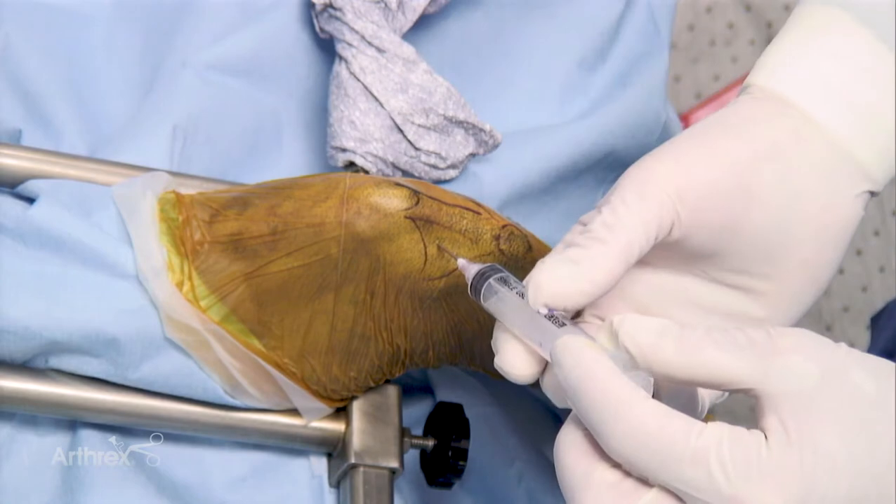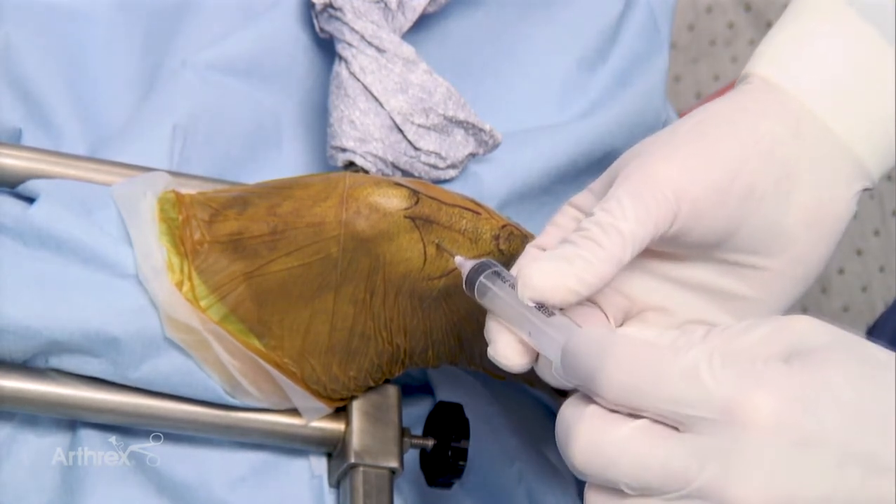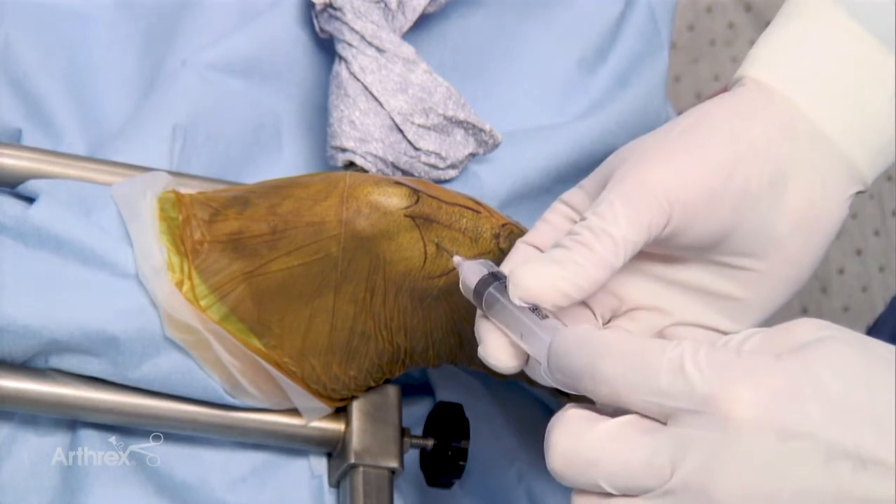Slowly insert until the joint space is breached. Aspiration of joint fluid at this stage is important, particularly if joint fluid examination is to be performed.